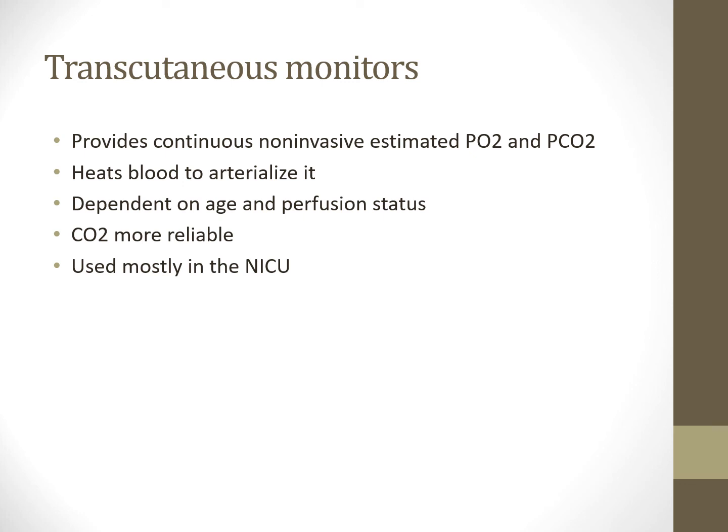So please, please watch your end-tidal CO2 when you have these patients on mechanical ventilation. Understand that as you see it drop and the gradient increase between end-tidal and PA CO2, you're actually doing these patients harm. So you should see them close to each other. If you do not, there's a dead space process, and it could be a sign that you might have to actually decrease your settings to get more optimal patient care out of this situation, because their saturations will drop as well, because now there's more CO2 being retained in their system because there's less blood actually getting rid of CO2.